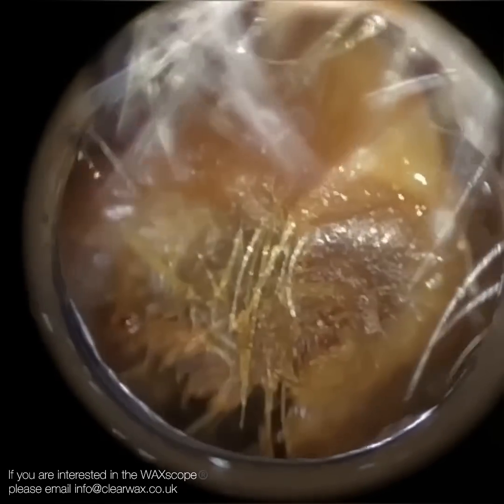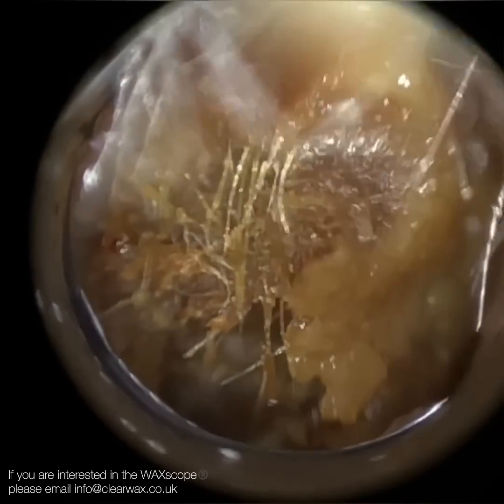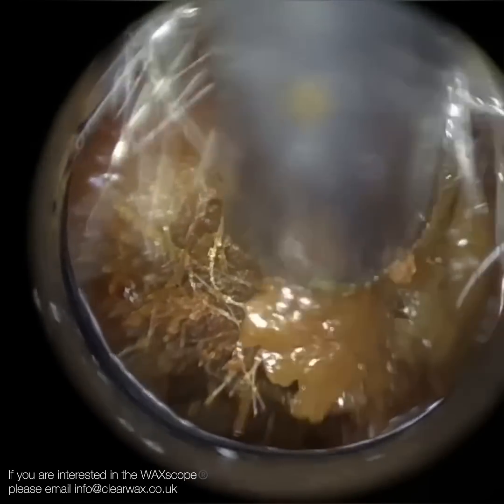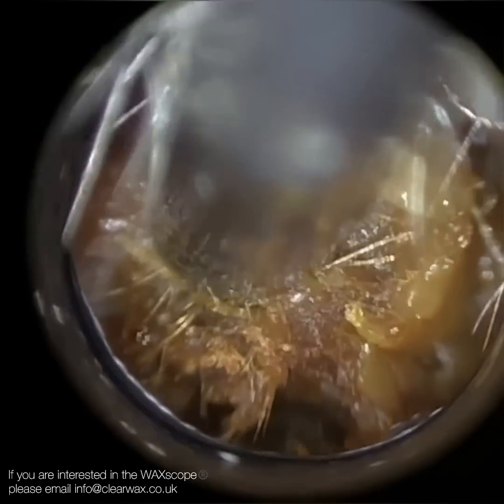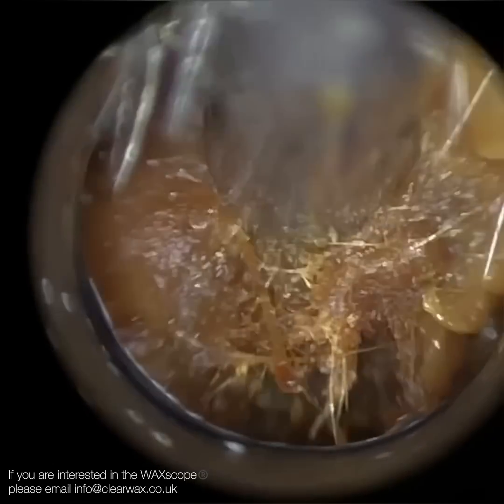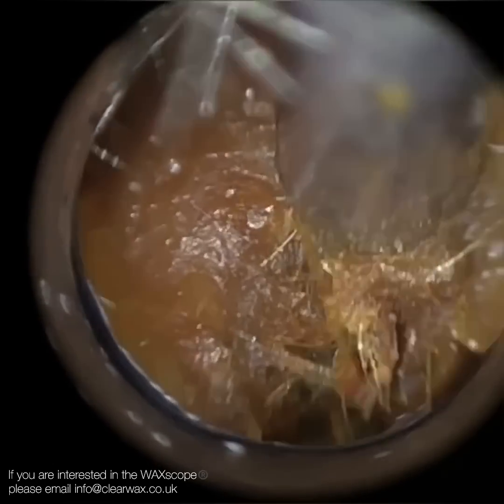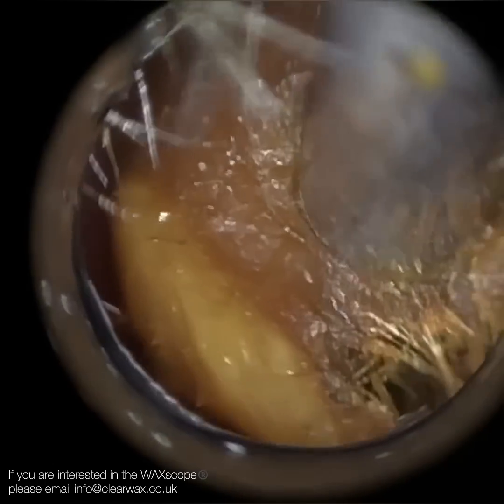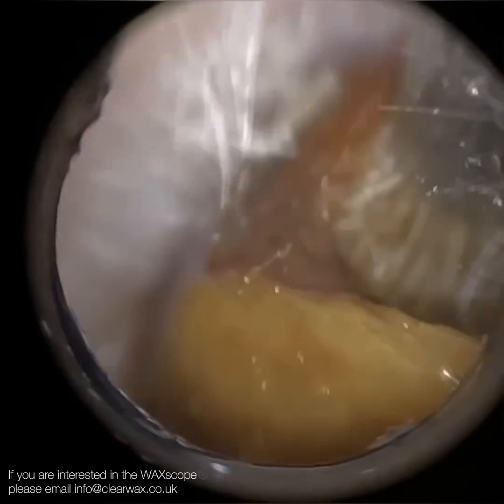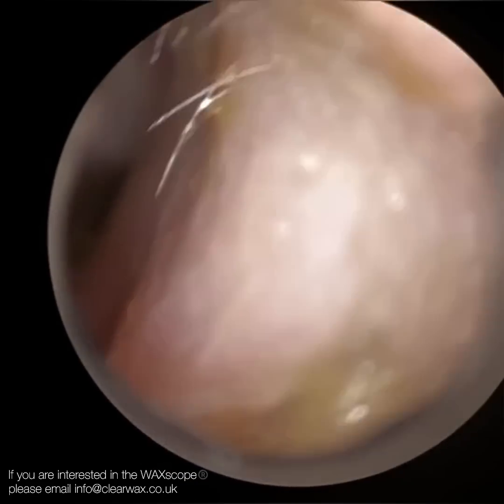Most people in the UK still don't use an endoscope, for many different reasons, but probably the biggest reason is that it's quite a difficult skill to acquire. Unlike with the Waxscope, microscope, or head loops, there's no speculum involved. You're having to stretch and dilate the ear canal using the side of the endoscope, requiring a lot of bilateral integration and coordination between both hands. A lot of people really struggle to get the grip and keep the hand stabilised.